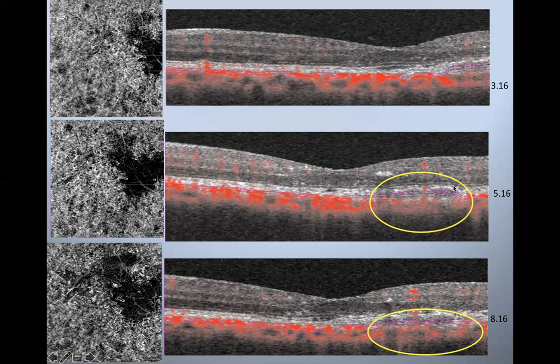Two months later, you can see this area here looks pretty much the same. Nothing's changed, but look how big this darkened area is now, number one. Number two, look at that blood vessel I was talking about. It looks a little bit bigger as it's kind of going through here. And this area that got kind of bigger out here has some other new blood vessels or small blood vessels that are perfusing through it that look a little odd.